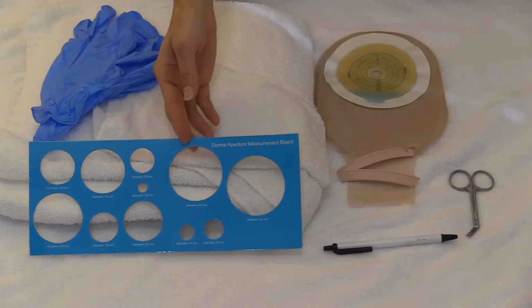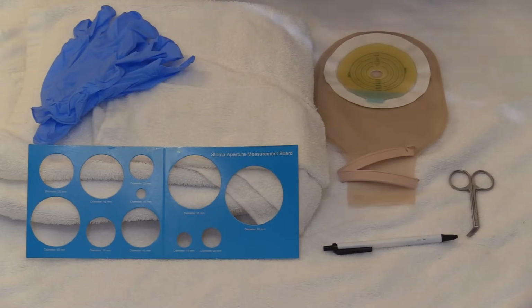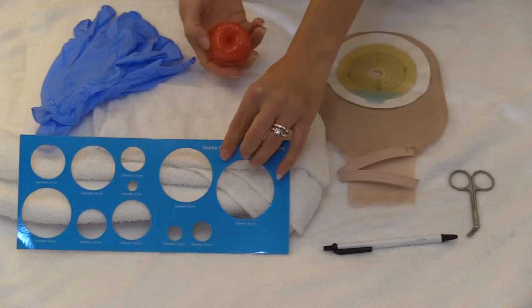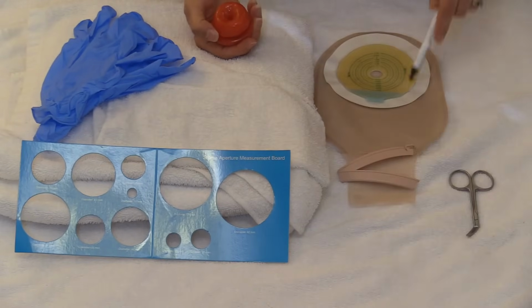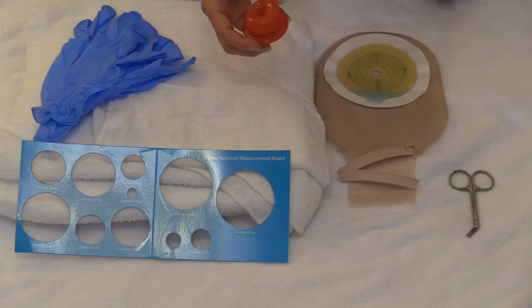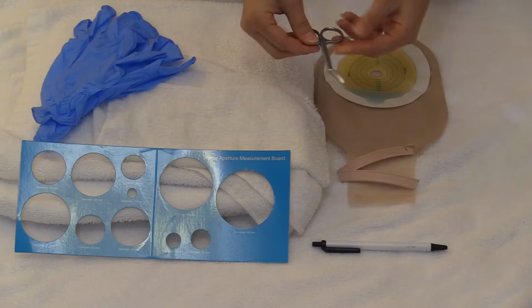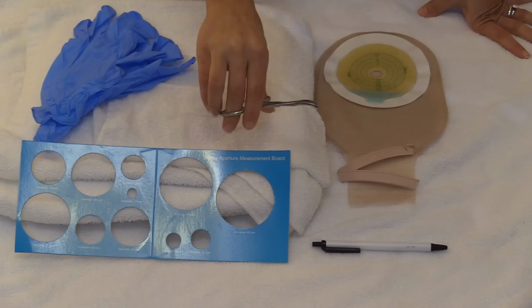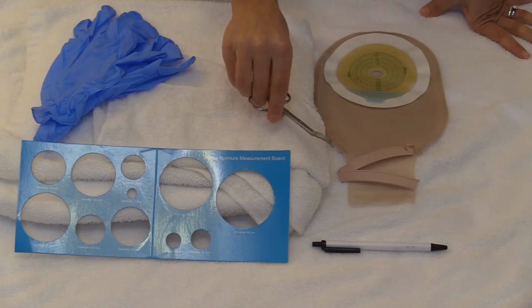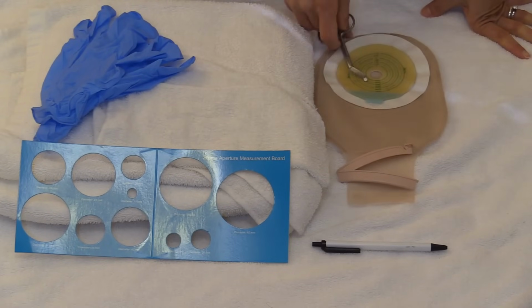Another thing you will need is a measuring card, and these usually come in the kits. You will use it to measure the stoma because you will be cutting your barrier to the size of the stoma so you can apply it to the skin. You will also need some ostomy scissors. These scissors are special in that they're curved and they have a blunt tip, so you can achieve a circular cut instead of a jagged cut on the barrier.